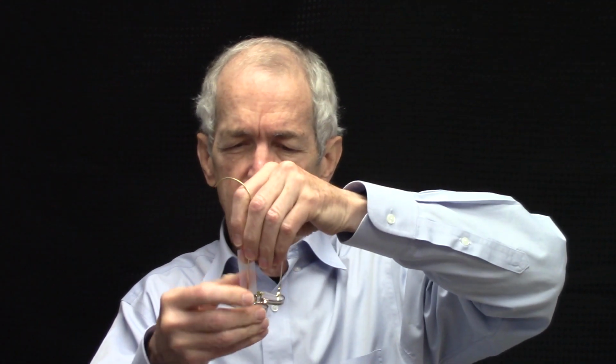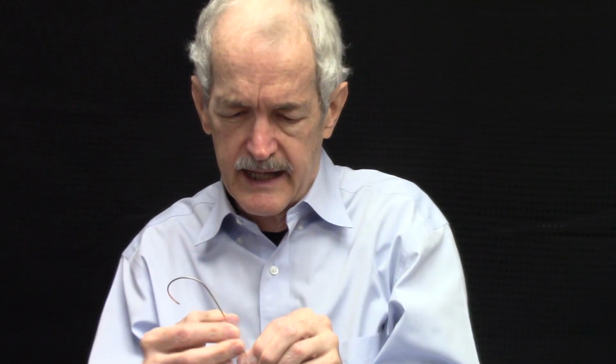So it's pretty simple. If you take, also you need some Scotch tape, just like that. So you take maybe a 4-inch strip of Scotch tape and you tape it to the inside of the stem of your glasses. And just like that. And so then you put your glasses on, and then you take the acetate sheet and maybe have it like this. You put it across your face and attach it to the Scotch tape on the stem of your glasses.